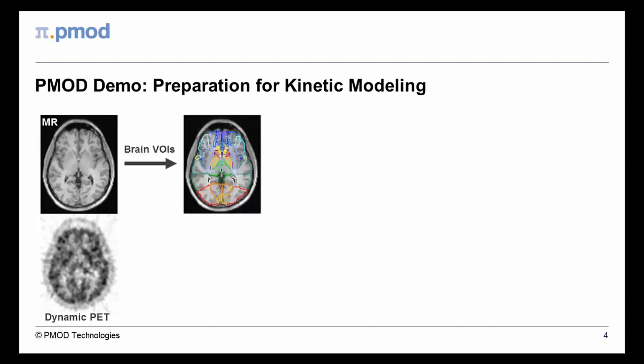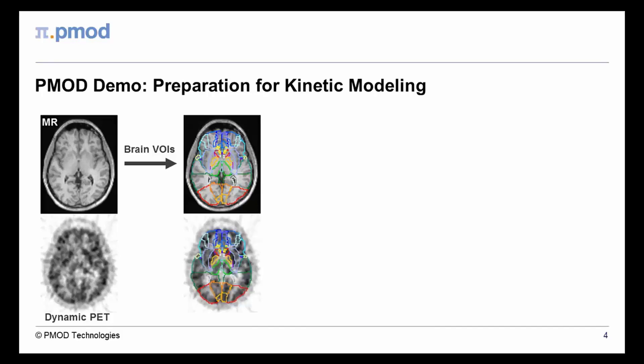First, a set of brain VOIs is generated from an anatomical MR image. Secondly, the VOIs are applied to a dynamic PET series, which has already been matched to the MRI using PMOD's fusion tool.